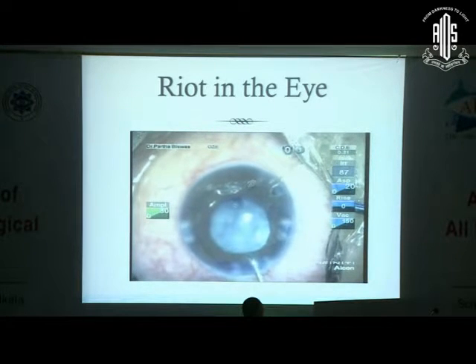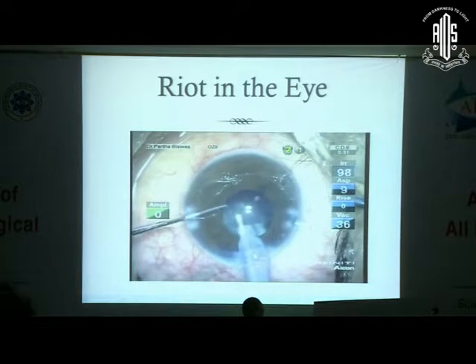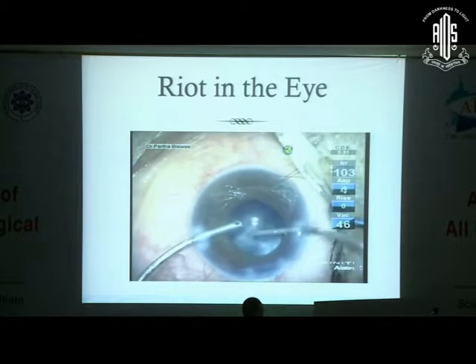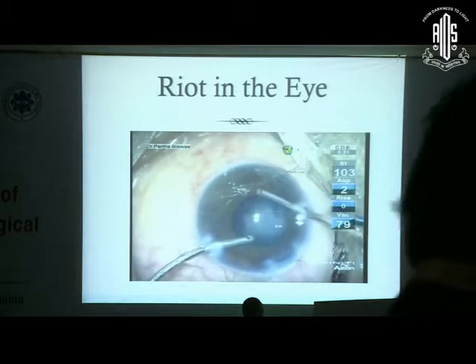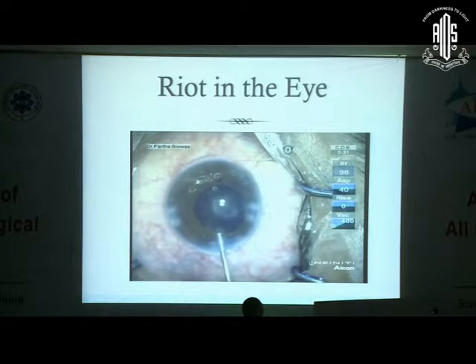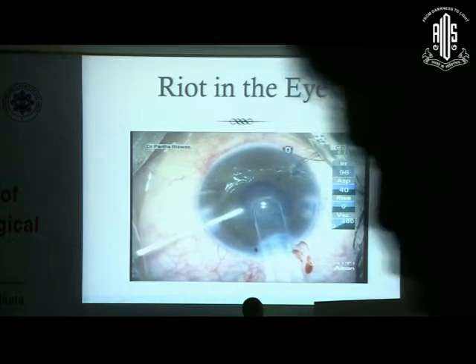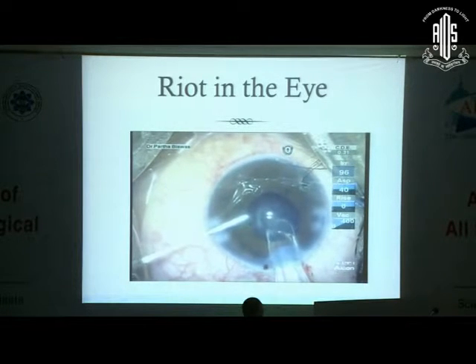Removing the cortex was not so difficult, but I was thinking about why this hypermature cataract had developed in just three months. The answer became very clear — you can see a plaque sitting on the posterior capsule. That plaque was the result of a lens touch that had occurred during the vitreous surgery. Very fortunately, my retina colleague Dr. Rupak Biswas was just in the next room and was called in. I asked him what to do at this stage, because with the plaque present and the bag open, the patient was not going to get any improvement of vision.